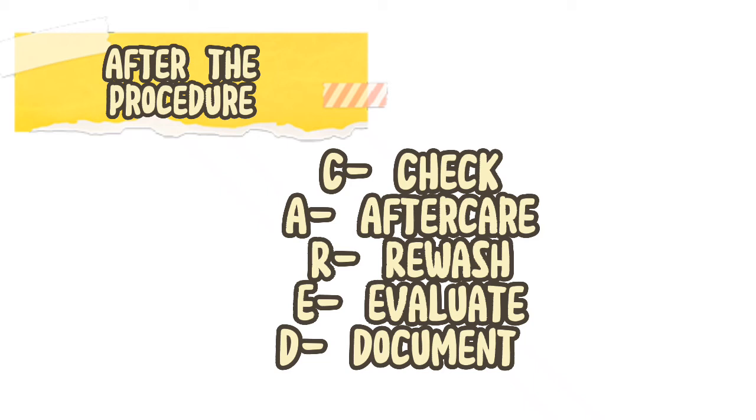Client's ability to bear weight and pivot. Number of staff needed for transfer and safety measures and precautions used. Length of time up in chair. Client response to transfer and being up in a chair or wheelchair.